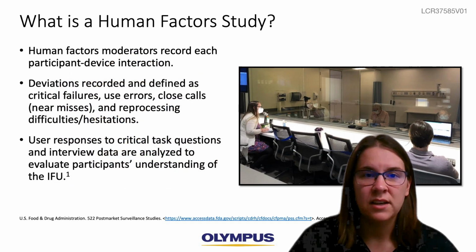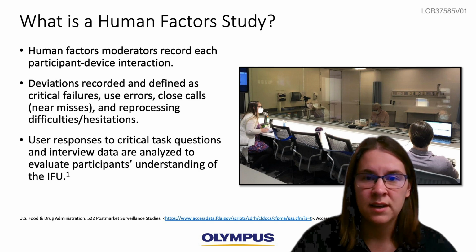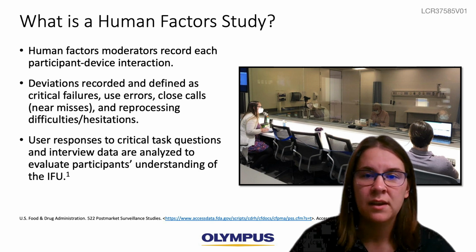During a human factors study, human factors moderators record each participant device interaction. They watch as each participant reprocesses the device according to the manufacturer's instructions. Deviations from the instructions are recorded, and the moderators will then define any deviations as critical failures, use errors, close calls or near misses, and reprocessing difficulties or hesitations. Reprocessing difficulties or hesitations are those steps where the participant may have had a slight confusion or a hesitation, but did eventually perform that step correctly.